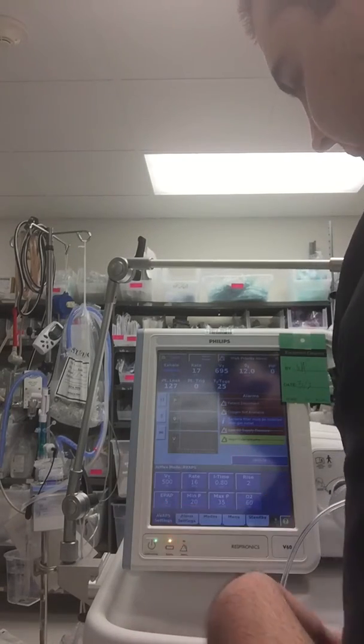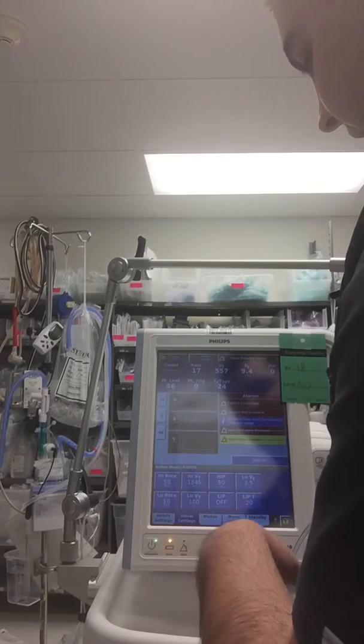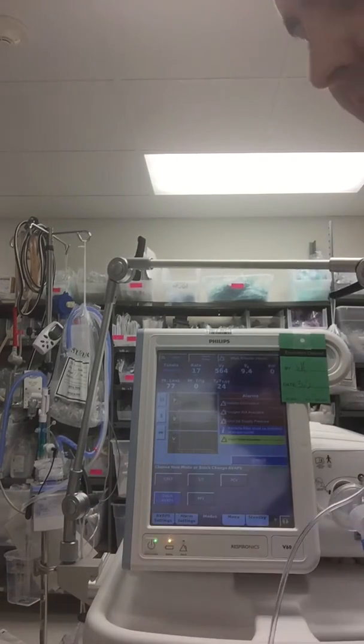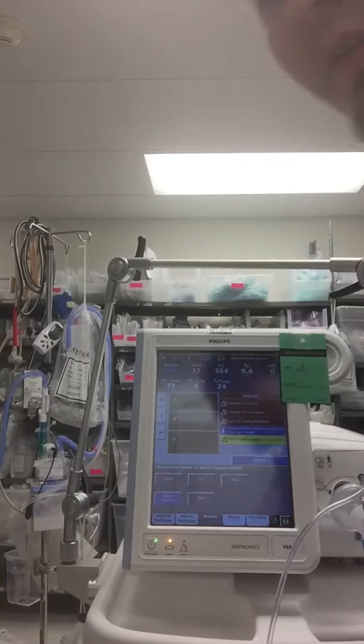And then the settings should be set, alarms should be set as well, making sure your patient doesn't go apneic, they're not in any respiratory distress, keep monitoring the patient.